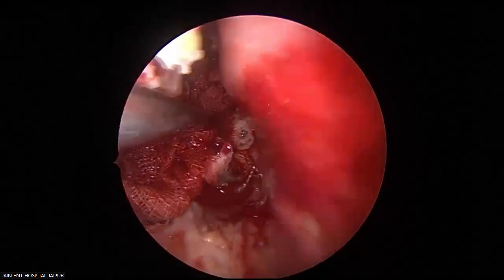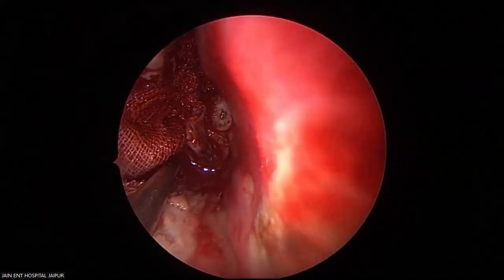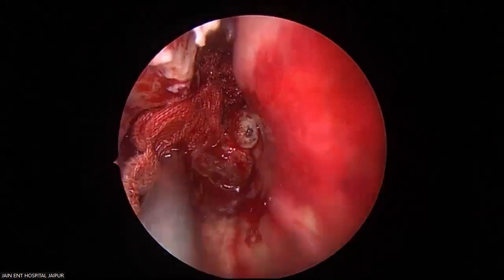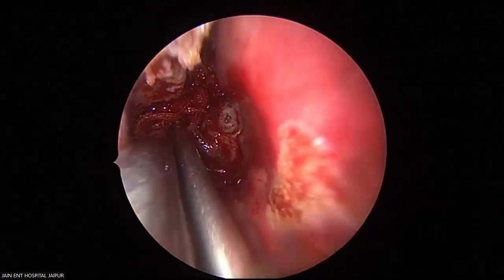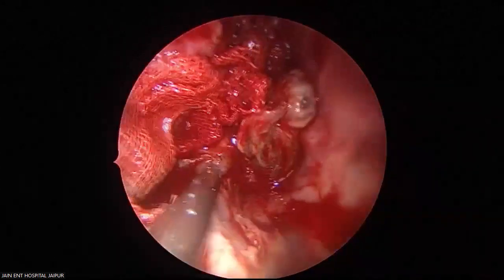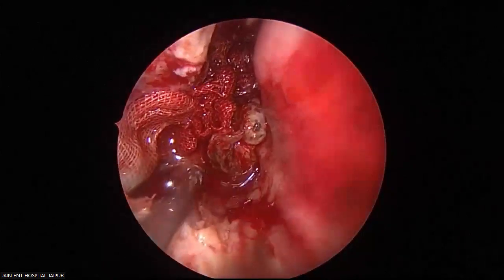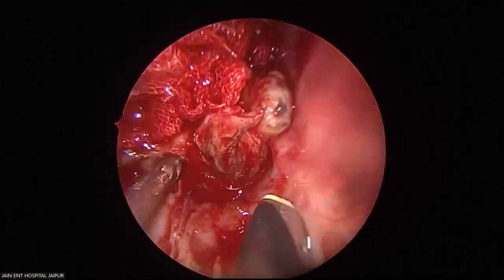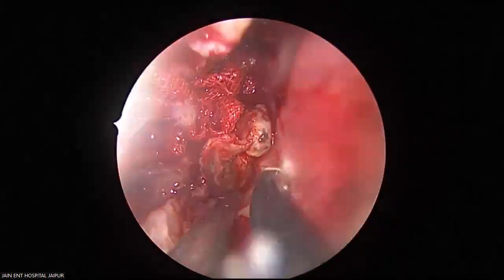Sometimes nasopharyngeal attachment bleeds very curiously. So what you need to do? See now I am going medial to it.